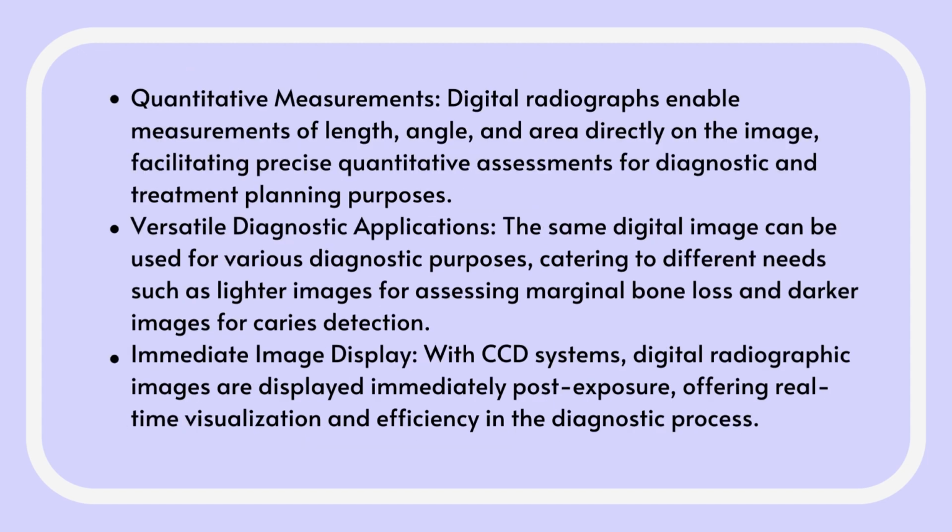Quantitative measurement. Digital radiographs enable measurement of length, angle, and area directly on the image, facilitating precise quantitative assessment for diagnostic and treatment planning purposes. Versatile diagnostic application. The same digital image can be used for various diagnostic purposes, catering to different needs such as a lighter image for assessing marginal bone loss and a darker image for caries detection.